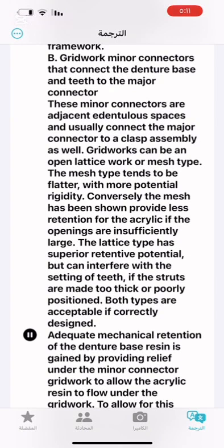If a minor connector fits tightly against an abutment below the height of contour, a wedging force may be created during functional movements of the framework. This wedging can result in increased tooth mobility. Alternatively, it may be difficult to seat or unseat the framework.